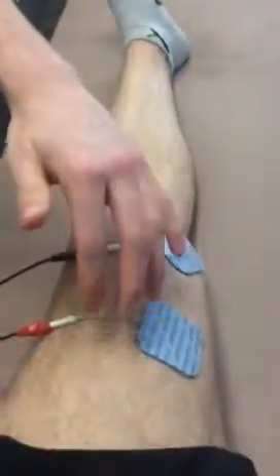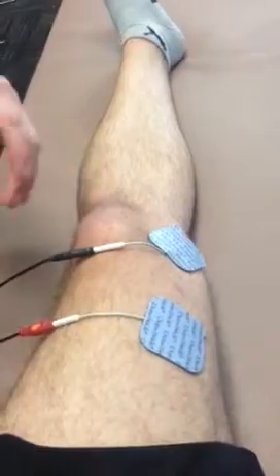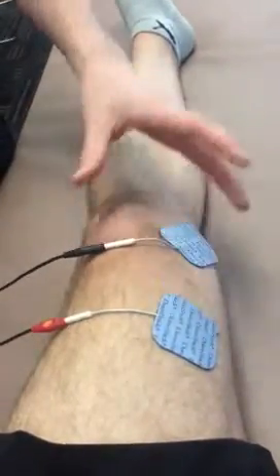And during the treatment time for both as well, you would look to see if there are any abnormalities during the treatment time, and as well as taking the pads off, you'd make sure that there are no skin irritations or anything like that. And I would also ask the patient throughout the treatment how they're feeling, what they're feeling, if it's too much, too little, just to adjust it to their comfort.